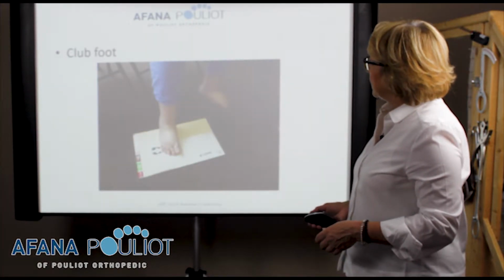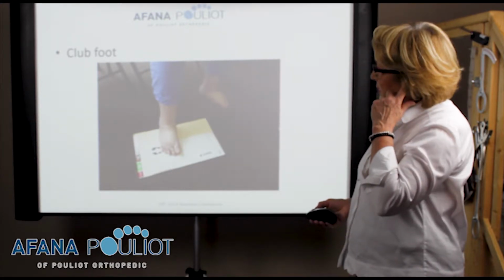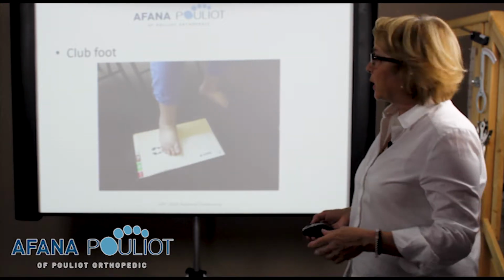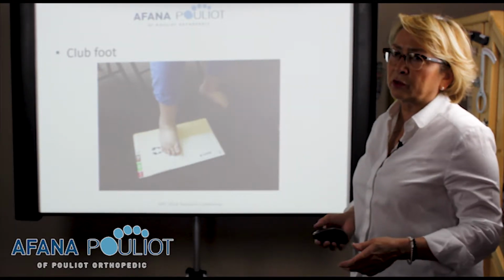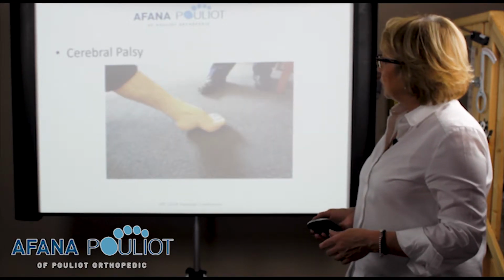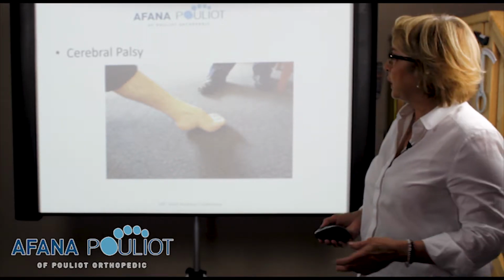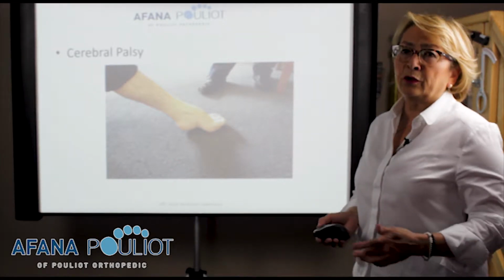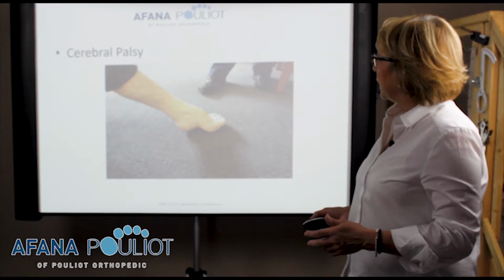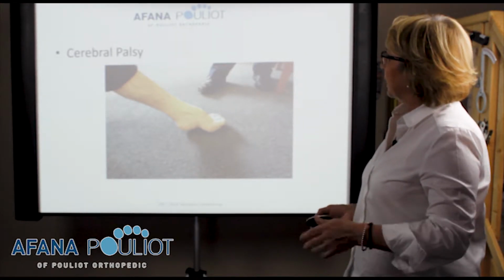Sorry. This is a clubfoot patient. The size of the foot, as you know, is usually so round that it doesn't fit into any regular footwear, and the stability is also a big issue with a clubfoot patient. This is a patient with cerebral palsy, permanent contraction of the foot. He's walking, but he needs a very stable foot that will allow him to be as stable as possible.